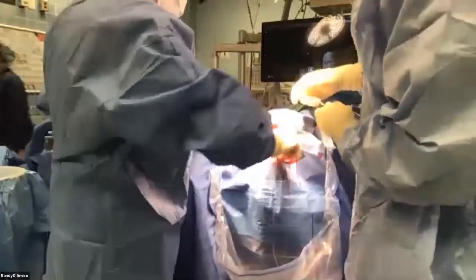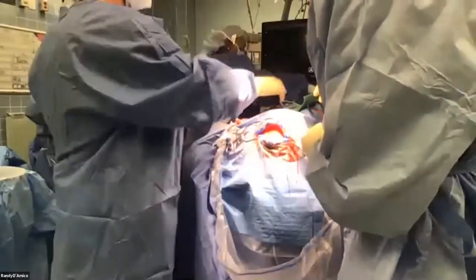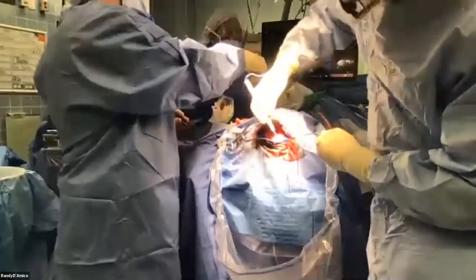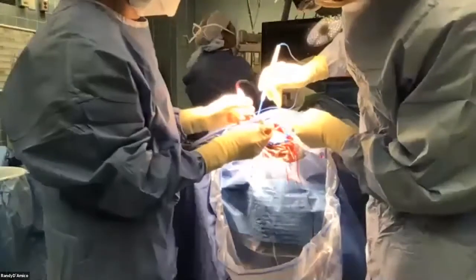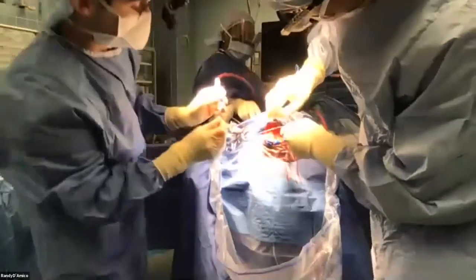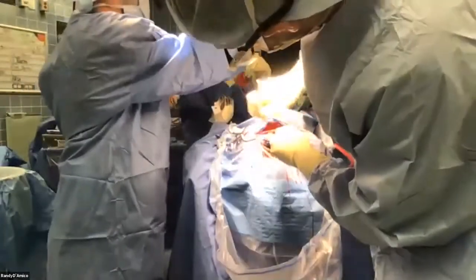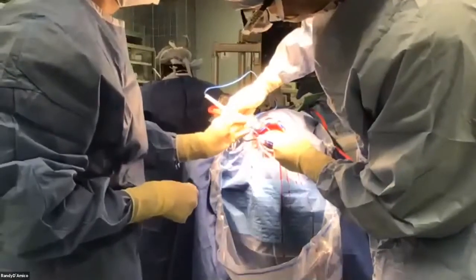Heavy curved Mayo? So first things first, use everything. Yeah, probably get it all the way. Have a knife, because this is big. Yeah. We need to retract it. Come all the way down to there. Have a knife back. Thank you. And so what we do here is we're just opening up the skin. And then the same thing over here. And back over here too. Take it all the way in here. We need to retract it. All right, heavy curve now.